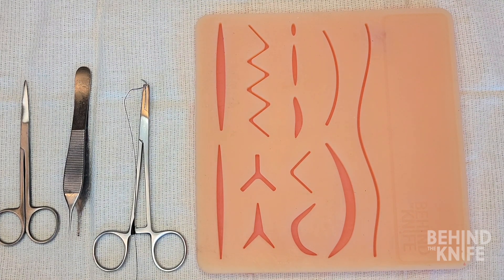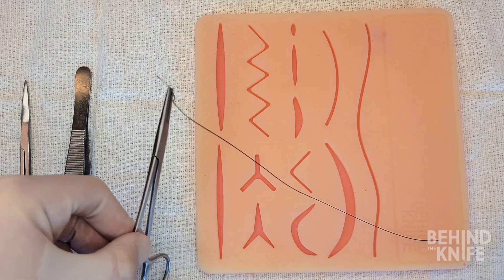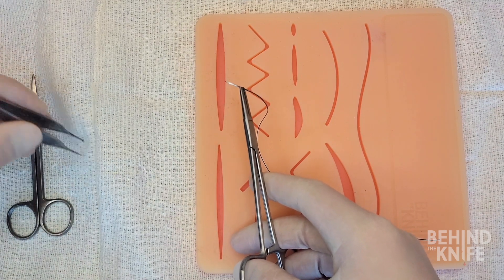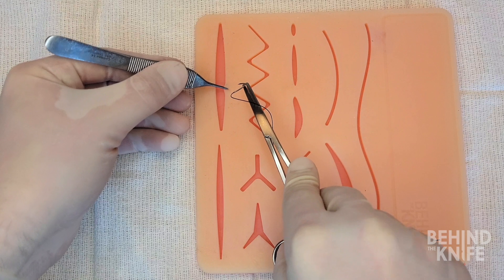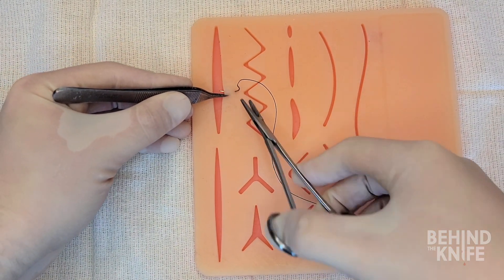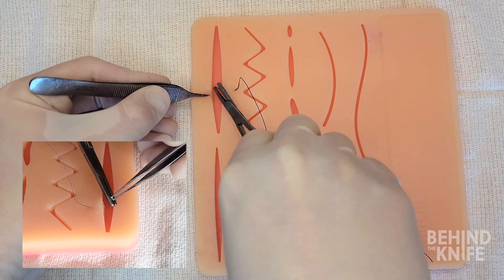We're going to start by picking up our needle drivers and loading our needle into them in the orientation for a forehand throw. The suture is thrown in a far-far, near-near fashion. The first throw is going to start around five to eight millimeters from the wound edge and will go fairly deep into the wound below the dermis.